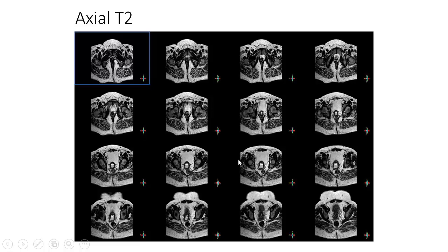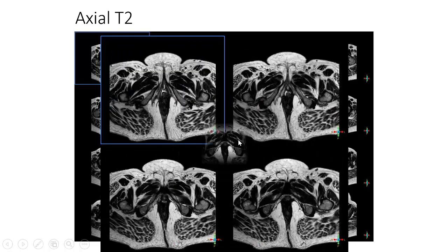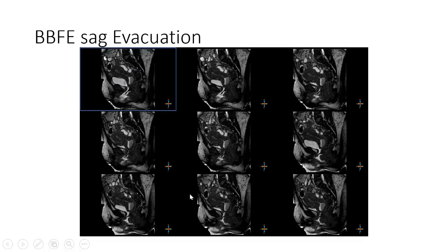Then after that, we did a precise MR pelvic floor in order to detect this on MRI. So here we can find that the vagina could not be delineated to the lower part. Here is the vagina and urethra, and then after that you cannot delineate the vagina. And this is the micturating MRI, where we see here the confluence.